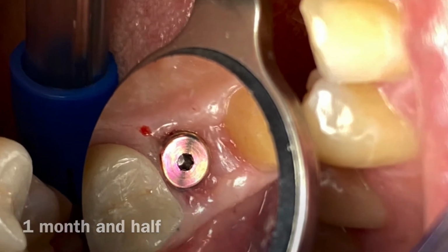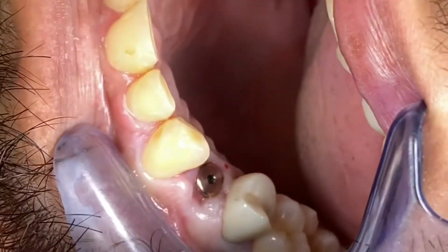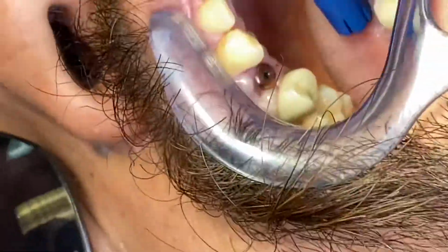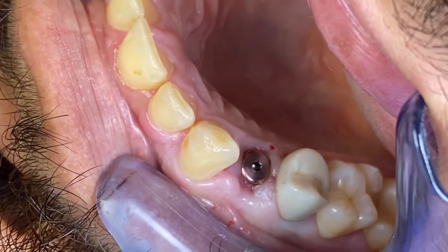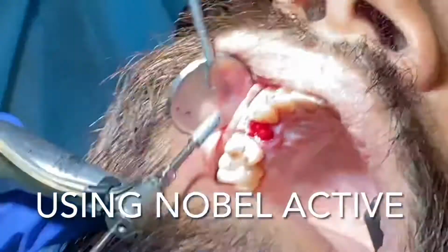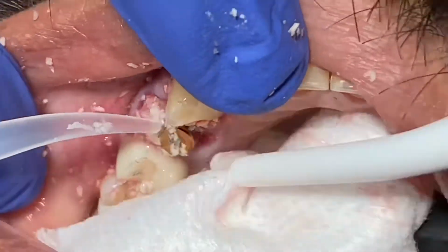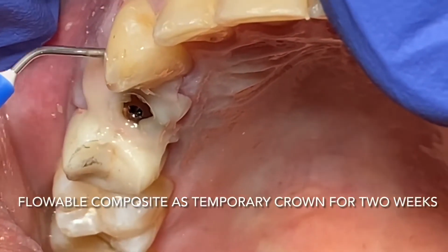Looks pretty nice. I'm hoping to follow up the case and take an impression in about 2-3 months from now, depending on how things go. Anyway, the x-ray showed perfect. There wasn't any bone loss after what we have done, and the case seemed to be very positive, in the right direction. Just want to do a report, guys. This is one way to do the immediate extraction, implant, bone graft and temporary crown, and follow up in a couple months and convert into the impression and final crown restoration.